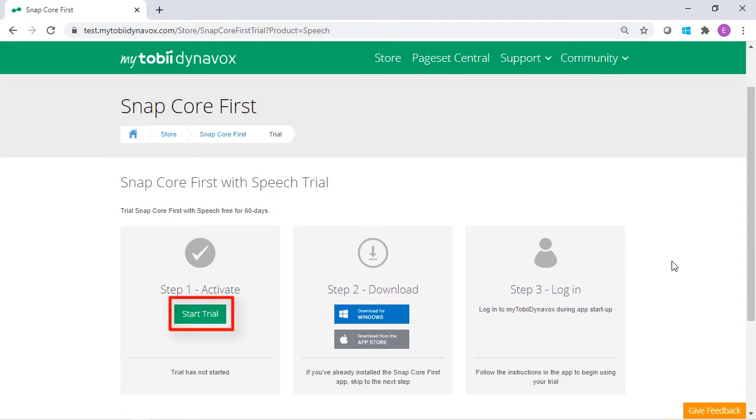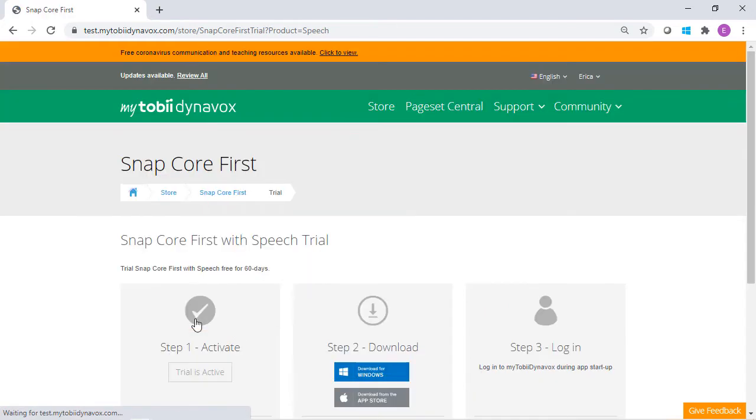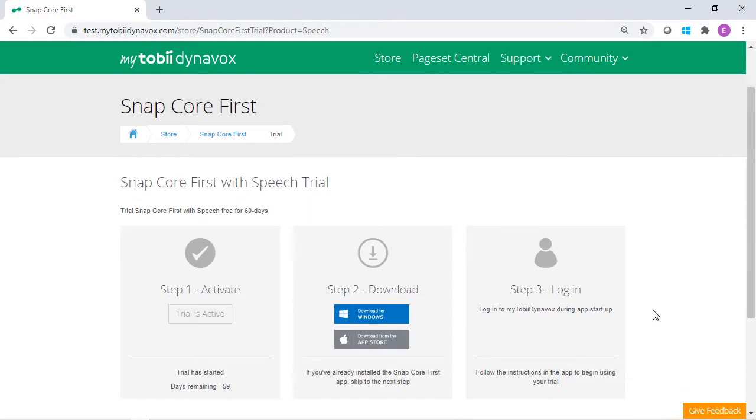Select Start Trial. This will officially start your trial period, and a day remaining countdown will appear.